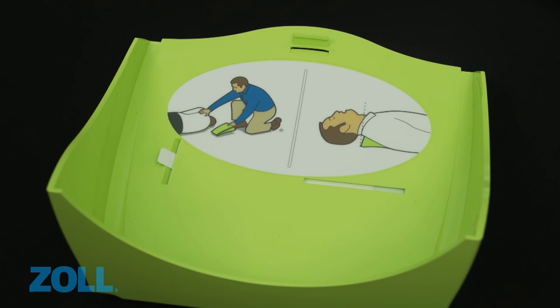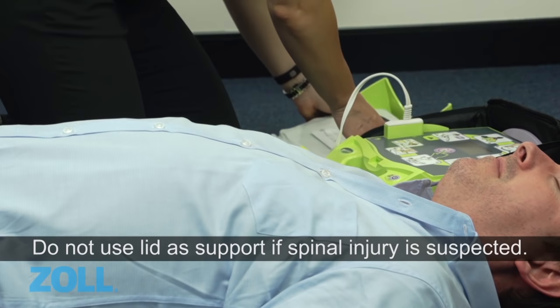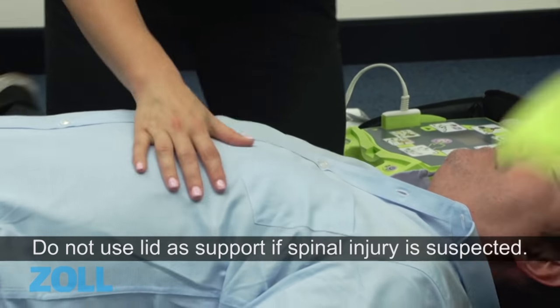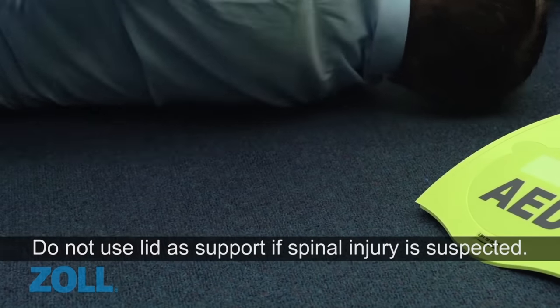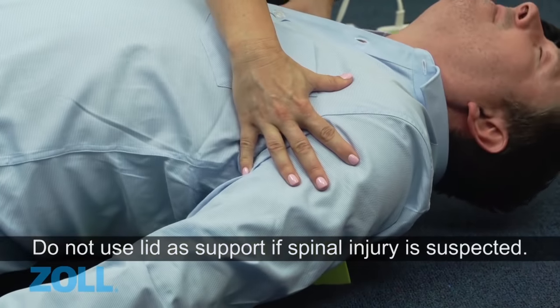If desired, the lid of the AED Plus can be placed behind the victim's shoulders. This will help support and maintain an open airway. However, you should not use the lid as a support if you suspect the victim has a spinal injury.